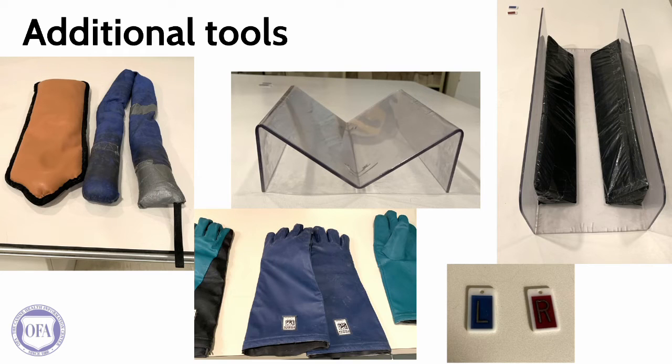Additional tools include physical positioning devices. This includes the use of troughs, wedges, pads, and sandbags where appropriate. These can more easily be used in dogs that have been sedated or anesthetized and may be patient-dependent, as each dog's specific conformation will require different needs. A narrow, deep-chested breed, such as a German Shepherd, may require more positioning devices, such as a trough and wedges, than would a small, broad dog, such as a French Bulldog.